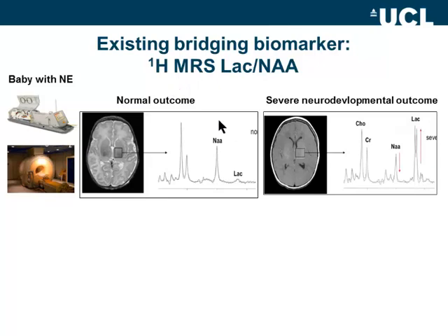proton spectroscopy here. What's quite interesting is, well, we've heard about it. A baby with a normal outcome would normally show something like this, with a relatively normal NAA and low lactate.